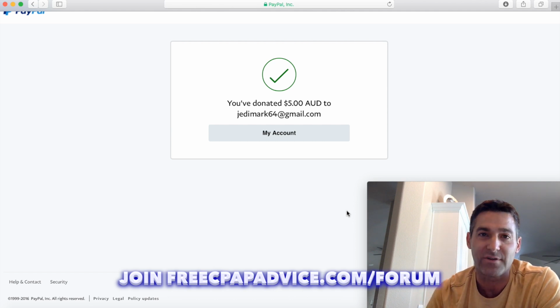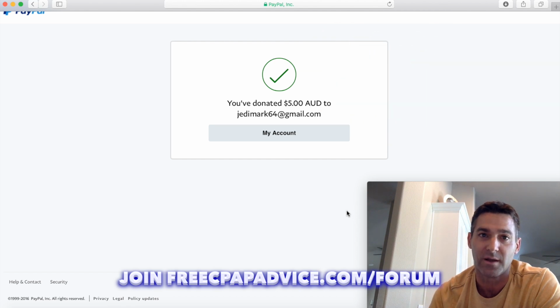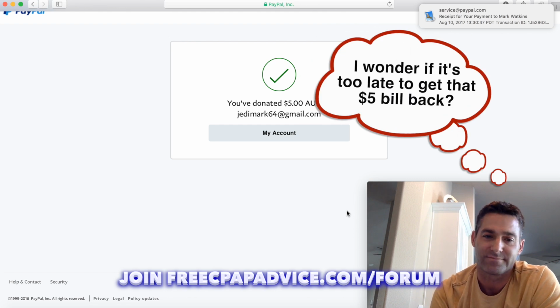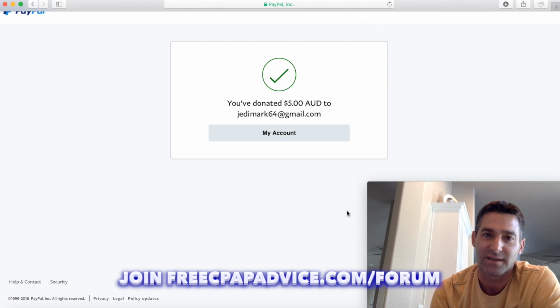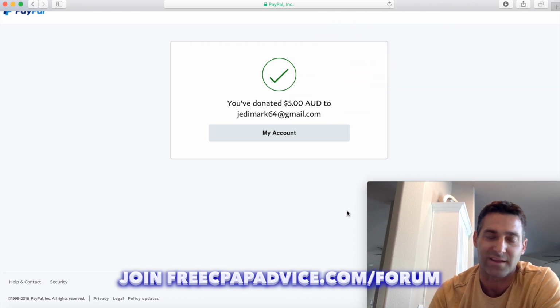Hey, and definitely download this program. It is, honest to God, a lifesaver for so many people, and I can't thank you enough for how many hours this guy's put in. It's fantastic. So just download it. At least send him a thank you note, and even $1. If 1,000 people send him $1, that equals.